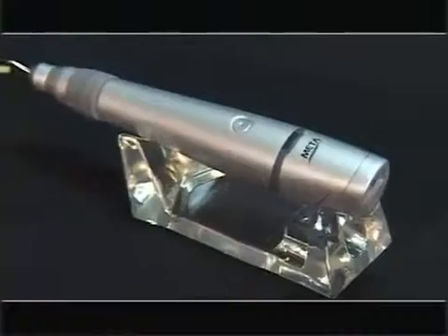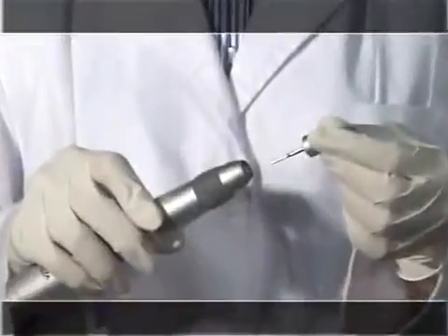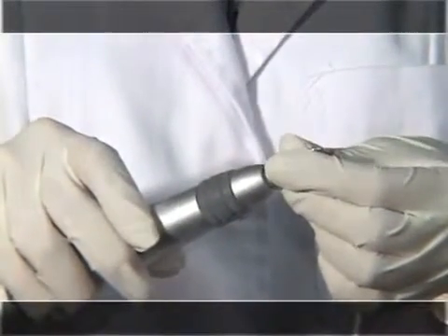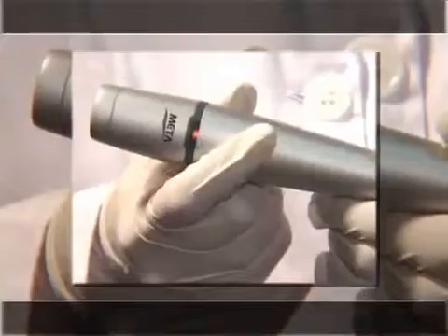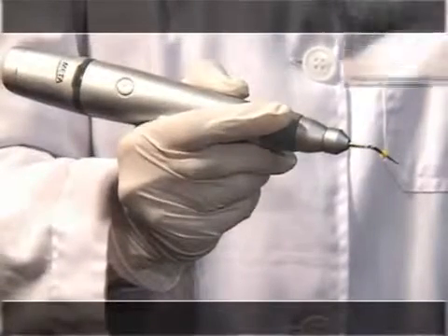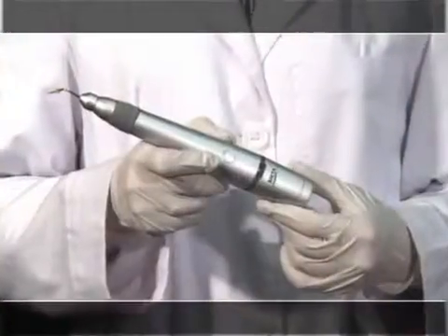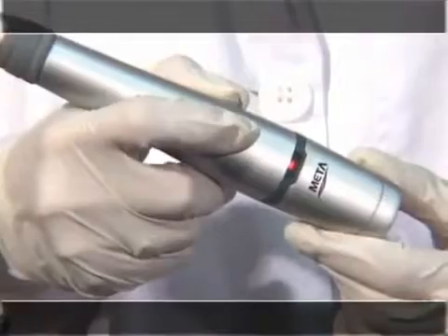This is the method of Master Pen operation. Before using the pen, mount the pen tip into the pen holder. Press the power select switch and select the output appropriate for the mounted pen tip. Next, press the operation switch — the lamp will flicker with sound as the pen tip heats. After operating, press and hold the power switch to turn it off.